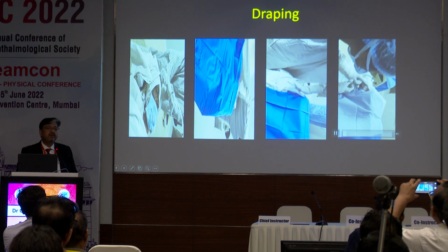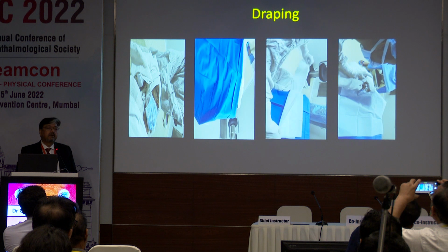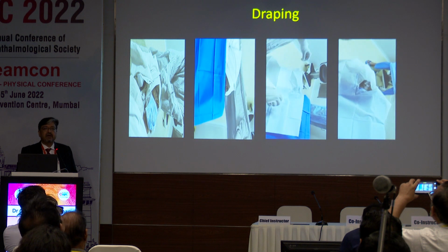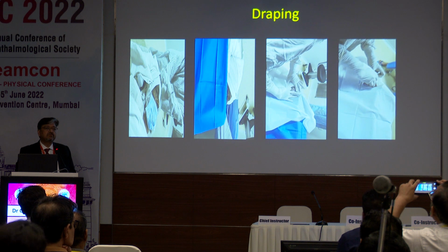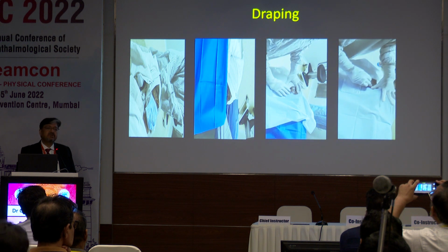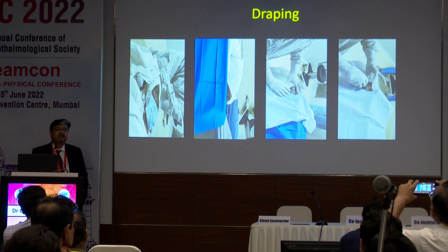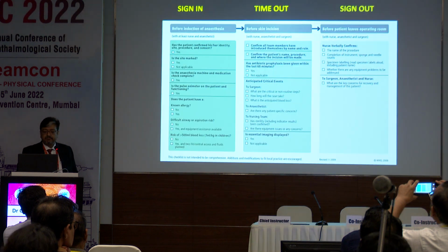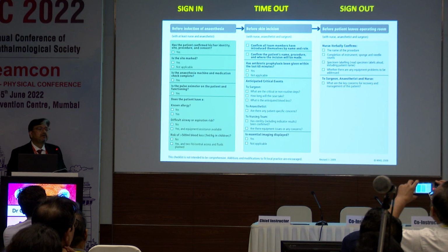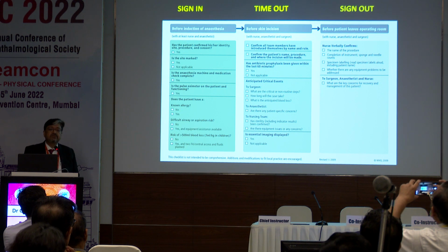and the incision is made very carefully. Again, out here, the incision should be made very carefully, taking care that you don't traumatize the eye or the lids, which has happened with certain surgeons, so you have to be extremely careful. So your staff or you, whoever is doing it, has to take extreme care that you don't cause any damage to the tissues underneath.